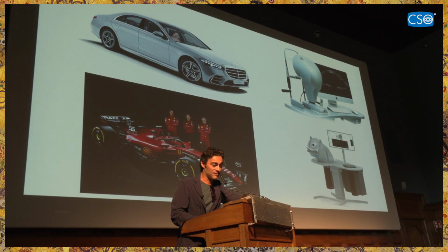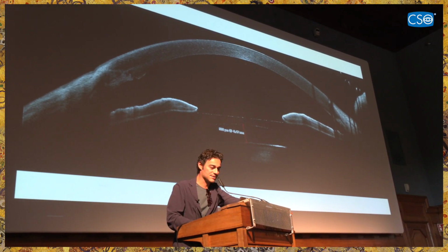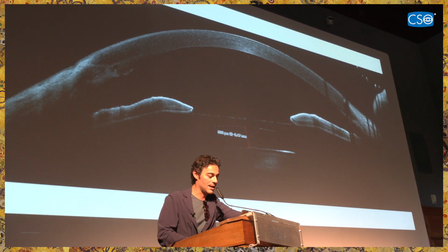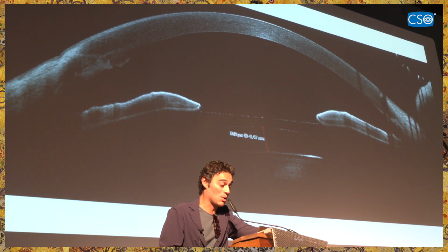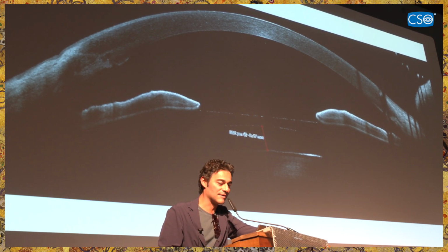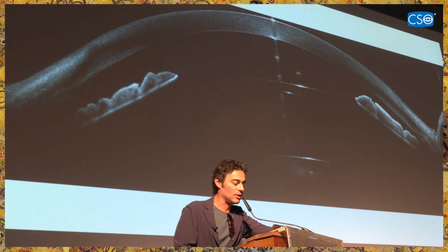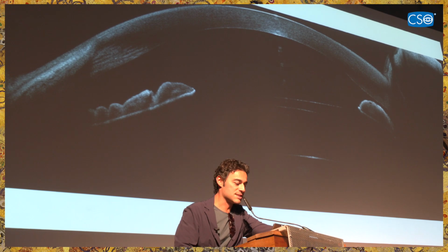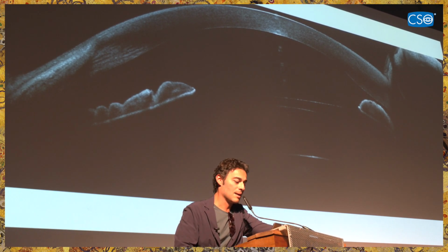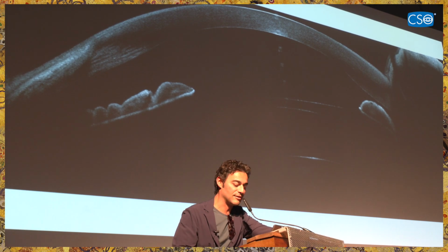Let me show you a few images from this beautiful surgery. I love the ICL. So this is an ICL which is perfectly implanted into the posterior chamber, and this is what we usually want to see the day after. But here, for example, is a case of extreme vaulting the day after. We waited 1 week. We could see some settling of the ICL, but still you can see the angle is very narrow and some edema was coming here, probably because of the modified flow of the aqueous.